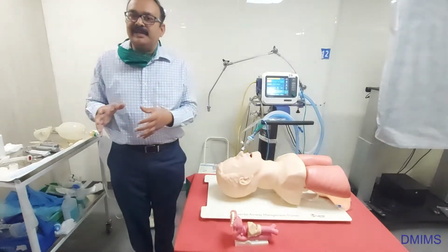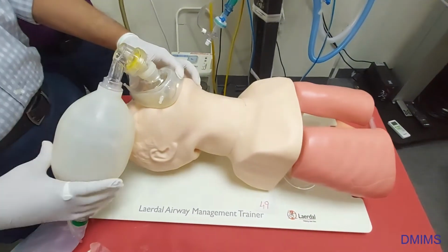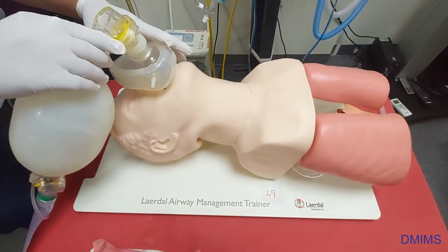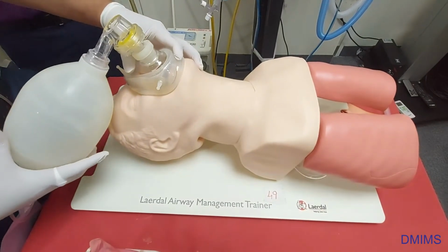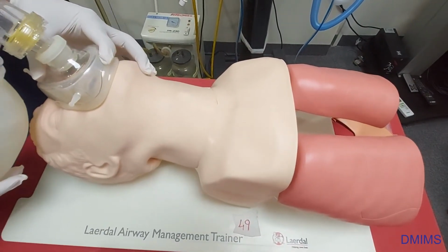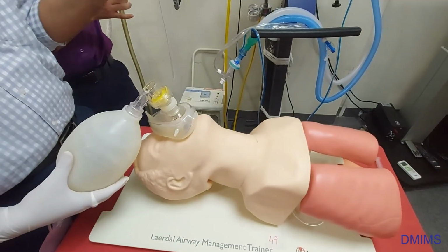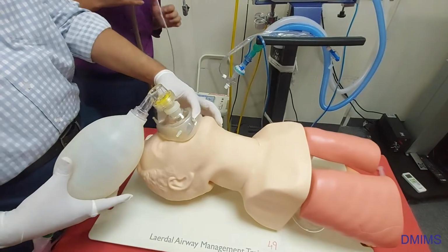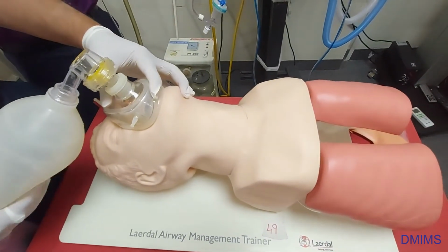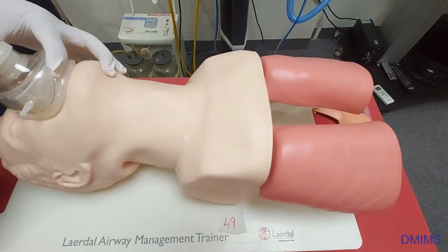So what do we need for intubation? As you can see, I can ventilate, but if I am not able to ventilate, I can push through an oral airway or nasal airway depending on the condition. What is important is to achieve proper ventilation of the patient. The most important thing along with all these instruments is suction. You should have a nice, powerful working suction at your side when you are doing the intubation, because it is very essential. You have to give at least 5-6 rescue breaths once you are sure that the patient is paralyzed and unconscious. Then you can proceed to the actual intubation.